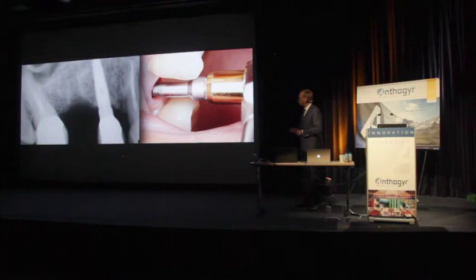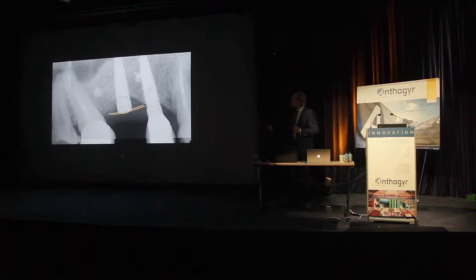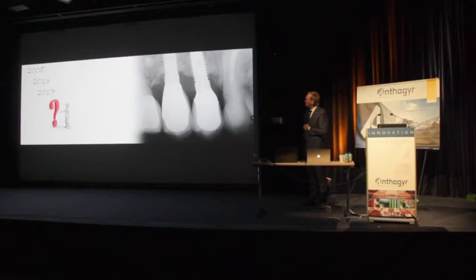So I waited 3 months after the removal of the implant, and then I placed another implant, slightly deeper, with some bone regeneration under a membrane, resorbable membrane. And I took an implant flat to flat with a smooth collar. So this was now in 2013. Just before I came to Paris, I made this X-ray, you see. My new implant is doing quite okay, although I have some remodeling, but I took a smooth collar.